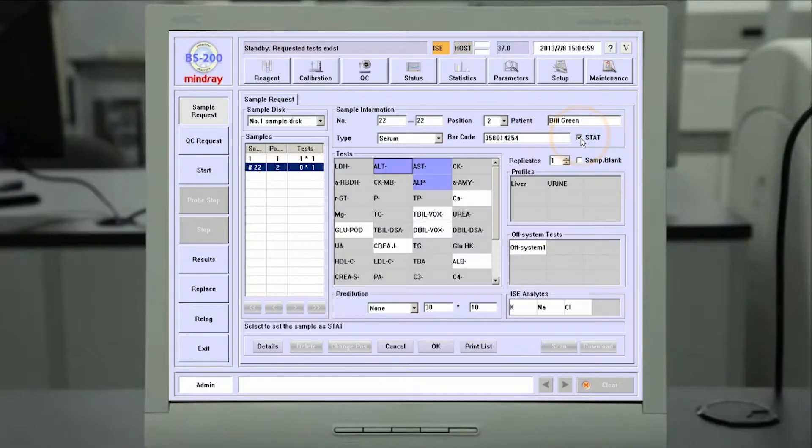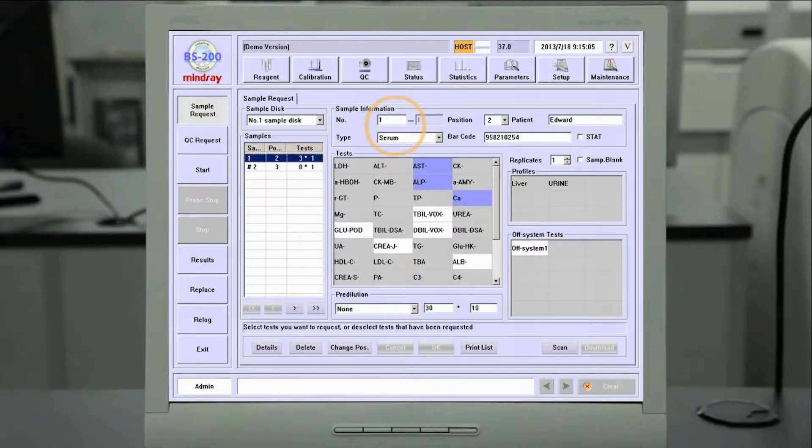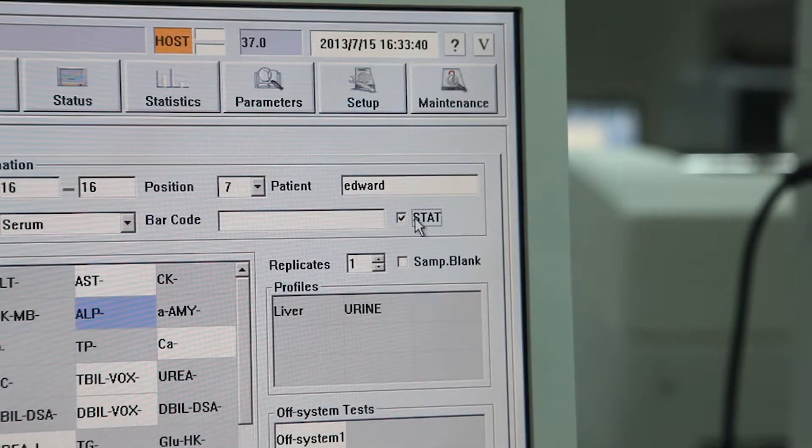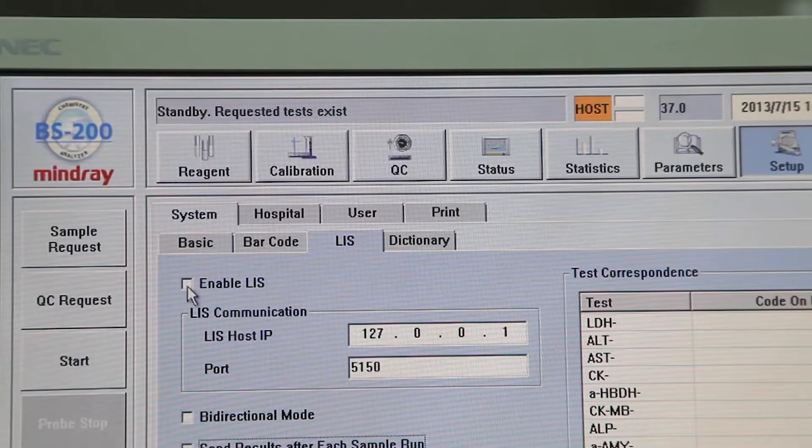The BS200 software supports STAT, routine priority, and batch testing. STAT samples may be programmed in the sample request screen or through the LIS system.